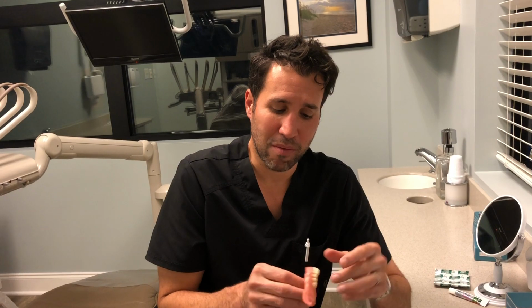It will give you a little bit of retention over locators. It will not engage the locator housing, but it will go over the locator itself, giving you a nice soft adaptation over the top of the locator. Just like having a soft reline material on the inside of the denture, and that resilience there. So it's really comfortable for the patient.